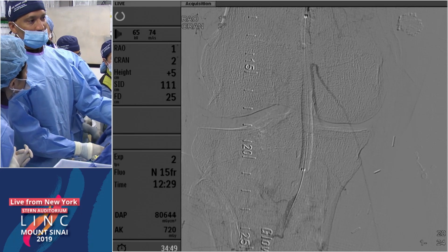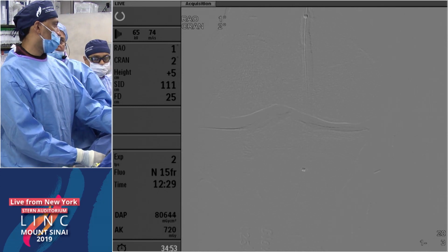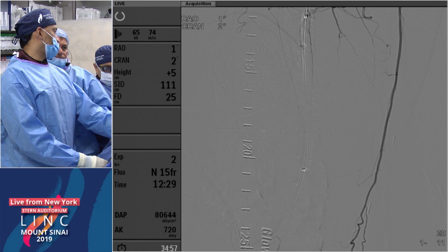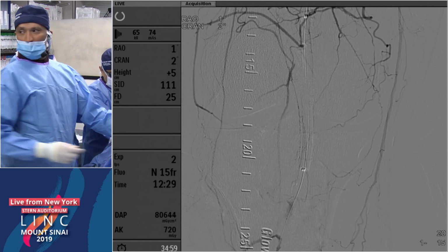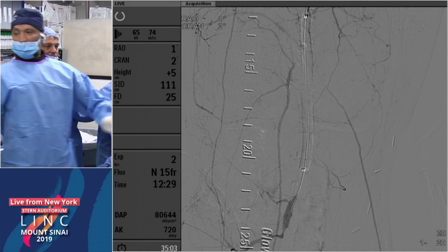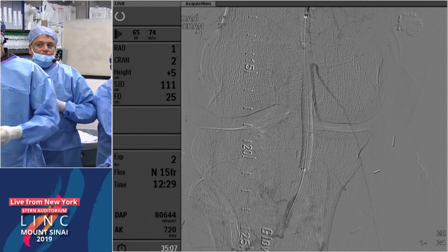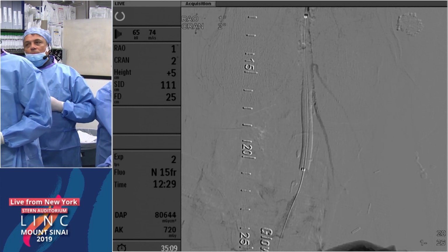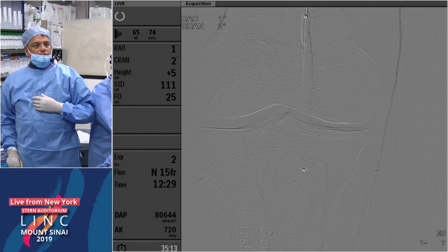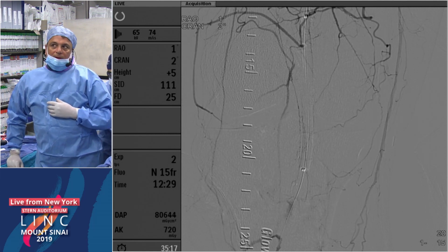So you could make an argument to treat the peroneal and popliteal and then potentially still reconstruct the loop at the same time to maximize the benefit. The Japanese trial, RENDEZVOUS, published last year, our Japanese counterparts really showed nicely that the rates of wound healing are significantly better with the complete pedal loop versus the partial pedal loop for those patients. But if you talk about complete pedal loop versus partial pedal loop, it also falls into the angiosome distribution when you're treating those patients.